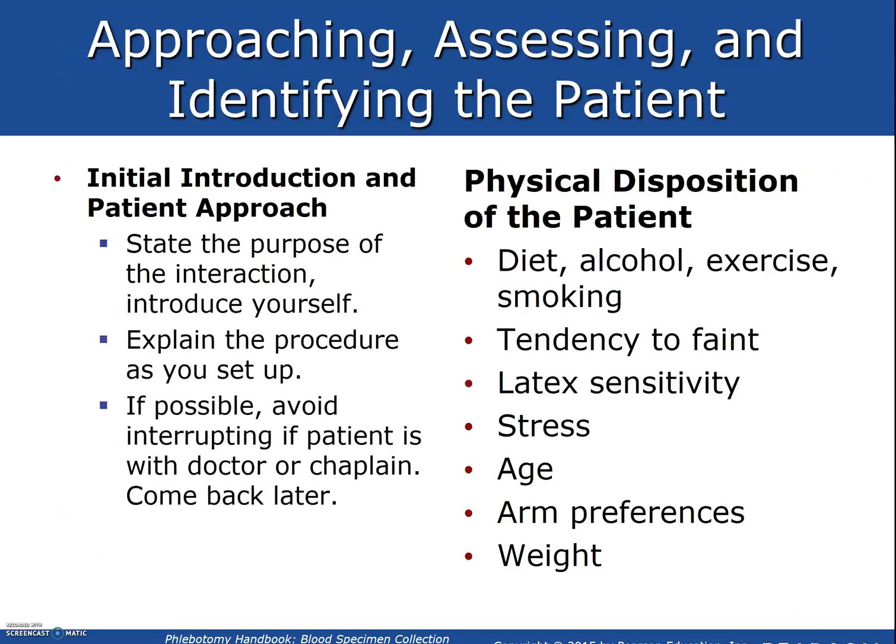We're going to state the purpose of the interaction. So for phlebotomy, you're going to state your first name and say, I'm a student from the lab. I'm here to draw your blood today. Explain the procedure as you set up. If possible, avoid interrupting if the patient has a doctor or chaplain. Come in later. Some physical dispositions we need to be aware of.